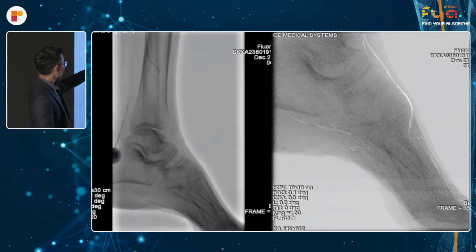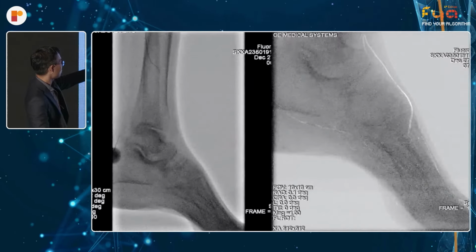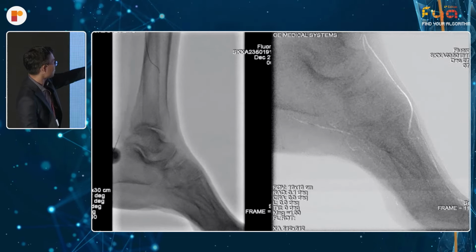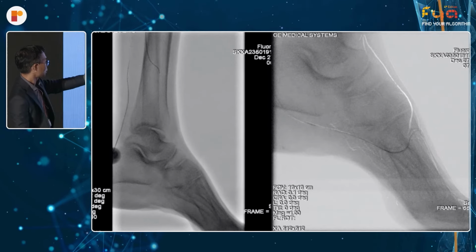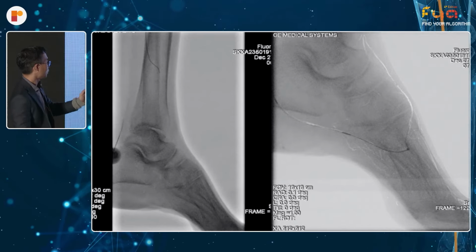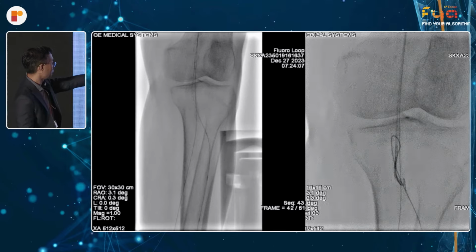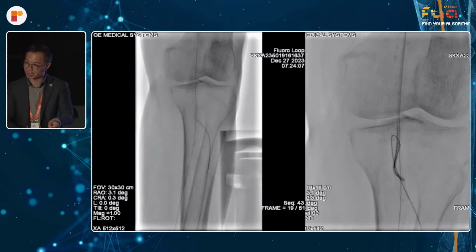So first, a retrograde puncture into the posterior tibial artery, and that will give me access through the posterior tibial artery to complete the pedal plantar loop into the anterior tibial artery. That will save me another puncture into the dorsalis pedis. And from there, you can go all the way back up to the top. Because I normally use a 6 French sheath, I'm then able to put in another Bernstein catheter from the top, and using that, what technique was it that you're saying you're pushing?